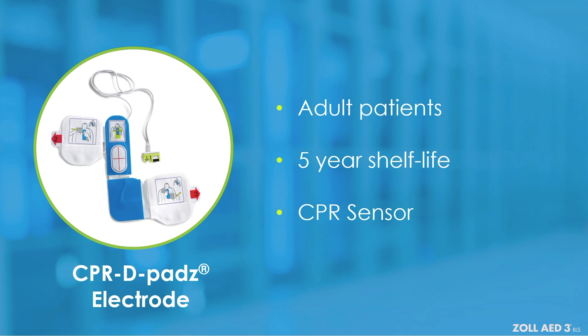The CPR D pads electrode is a one-piece construction, which decreases the potential of mishandling or damage and aids in the proper placement of the pads.